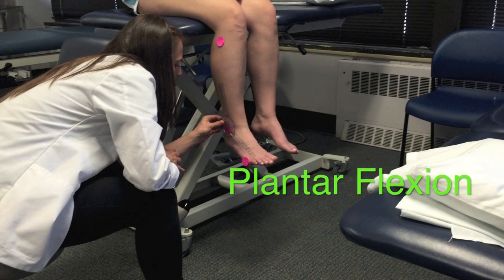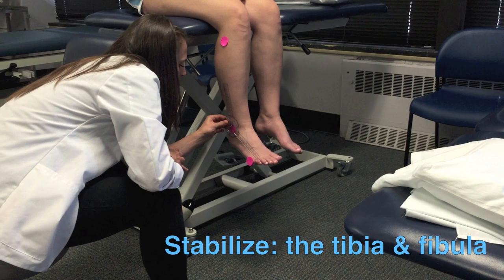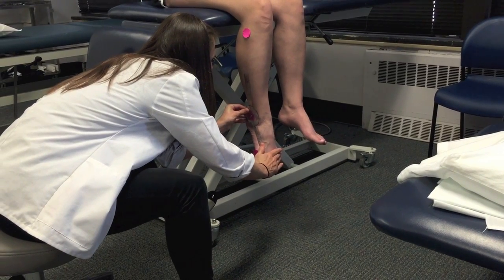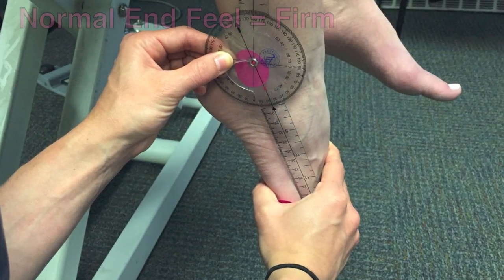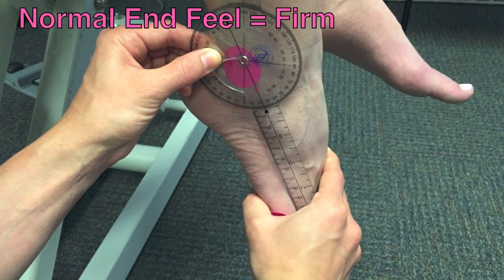Next, the PT will demonstrate how to measure plantar flexion. Make sure to stabilize the tibia and fibula throughout the entire motion. Push downward with one hand on the dorsum of the foot. Stop when resistance is felt or when compensations prevent proper motion. The end feel should be firm.